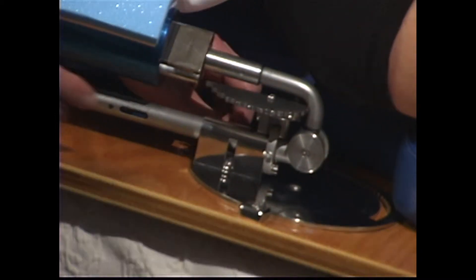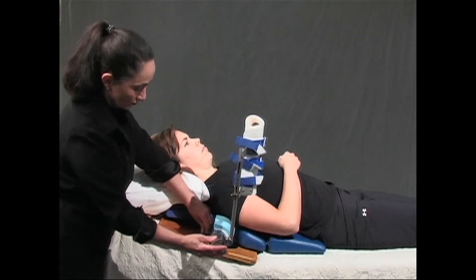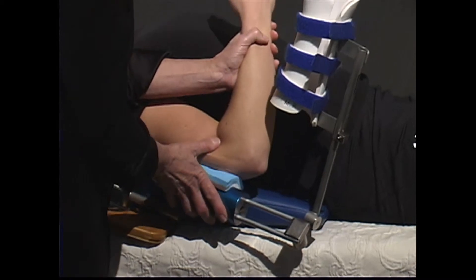Release the arm by pressing the button on the metal dial on the wood board until the mechanical arm is parallel to the patient. Then place the patient's arm on the blue foam pad on the cylinder.